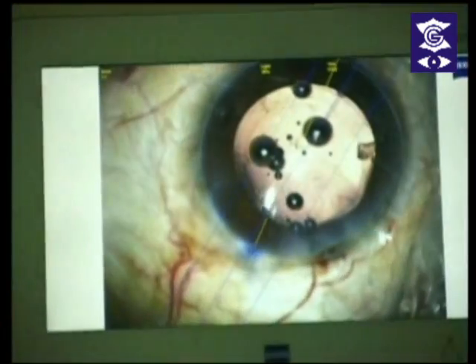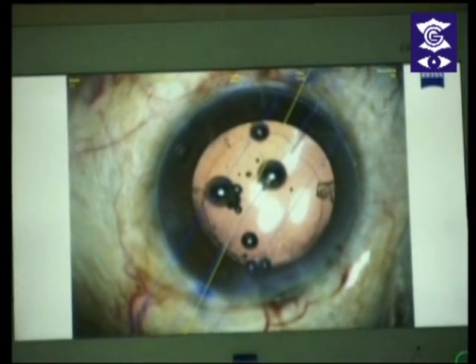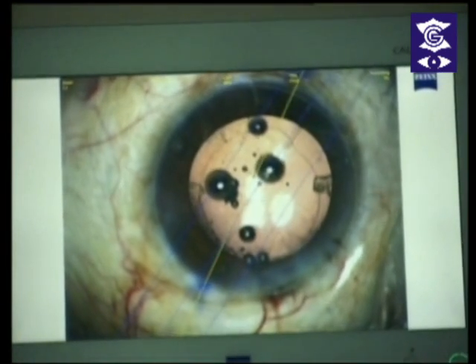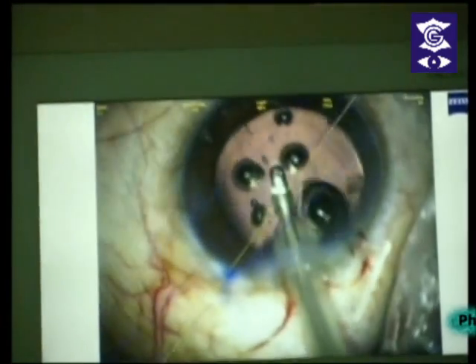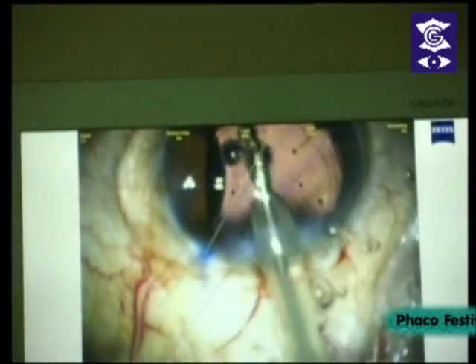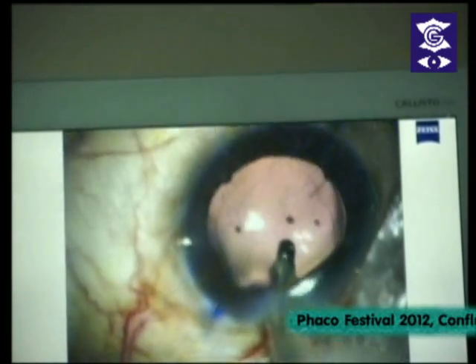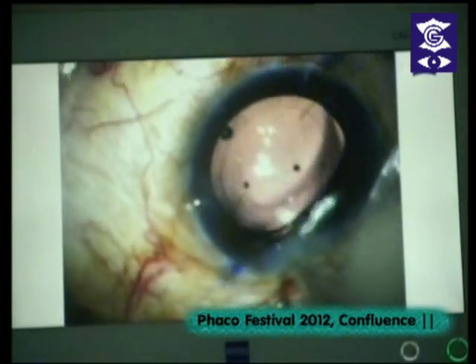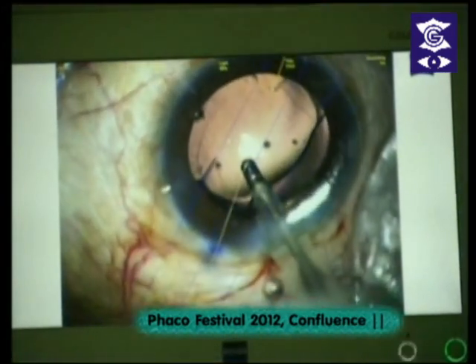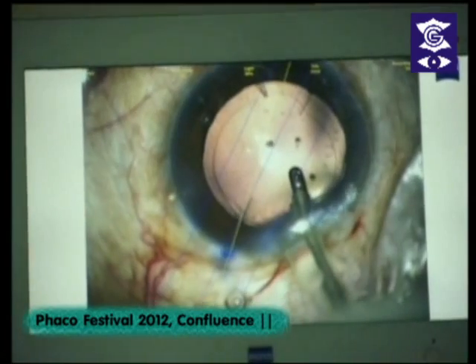That's the 8-degree axis — the coincidence is quite good. We'll take out the viscoelastic and then align it finally. I am using a coaxial I/A. It's important in these lenses to remember to take out the viscoelastic from behind the lens also. You always like to go behind the lens — you can nudge the lens aside, lift it up, and you can see the viscoelastic emptying out from the bag.